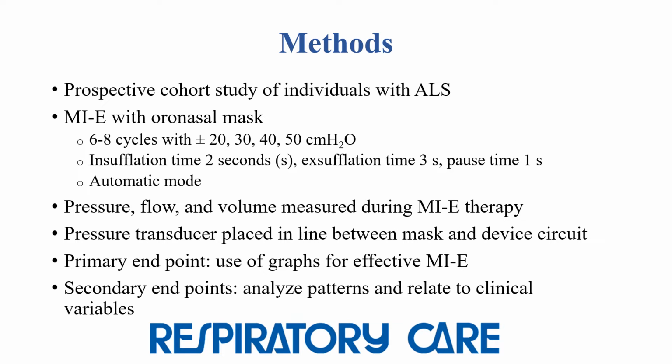This was a prospective cohort study of individuals with ALS hospitalized during a 2-year period from 2018 to 2020. MIE was administered with an oronasal mask using 4 different sets of insufflation-exsufflation pressures, including plus or minus 20, 30, 40, and 50 centimeters of water pressure for 6 to 8 cycles with an inhale time of 2 seconds, exhale time of 3 seconds, pause time of 1 second, and using the automatic mode.